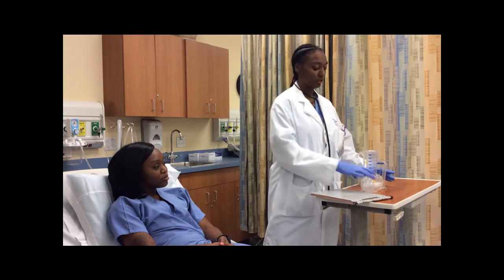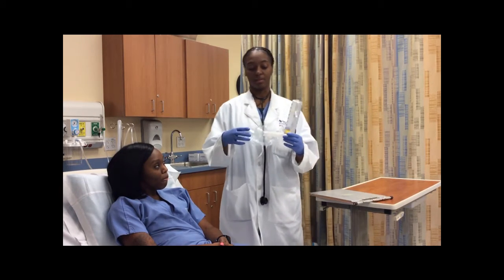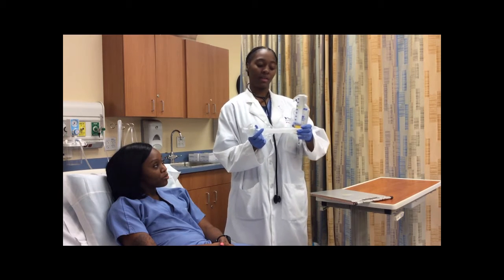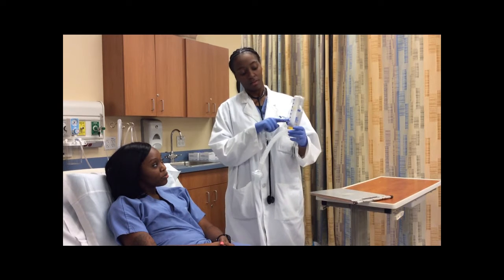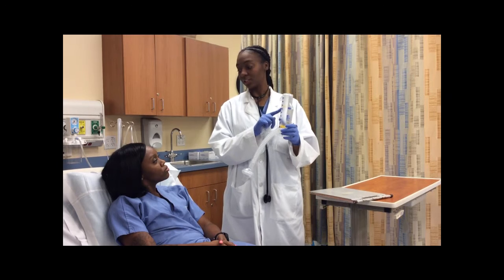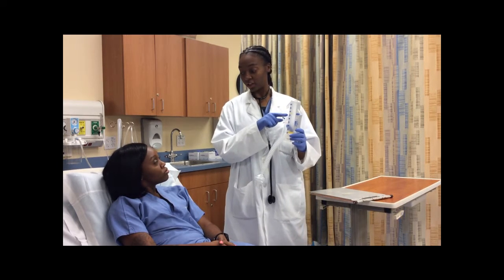Then I'm going to teach my patient on how to use the incentive spirometry device. Extend the tube so the patient can see their progress. This is where your target volume is, which is 2650. I got that by your height and your age.